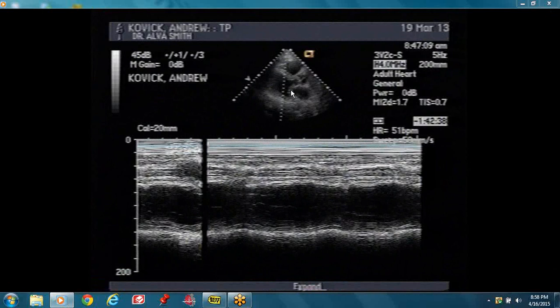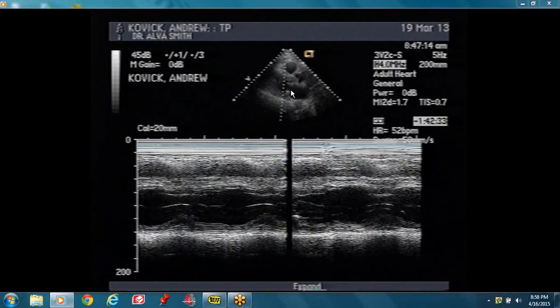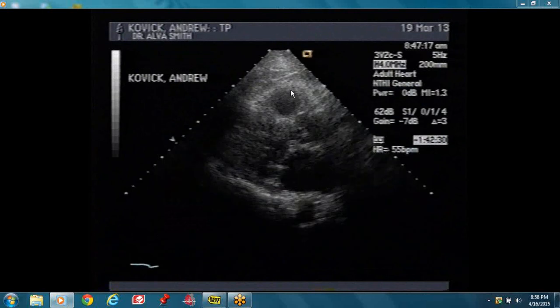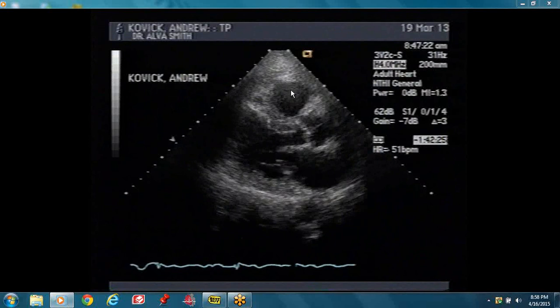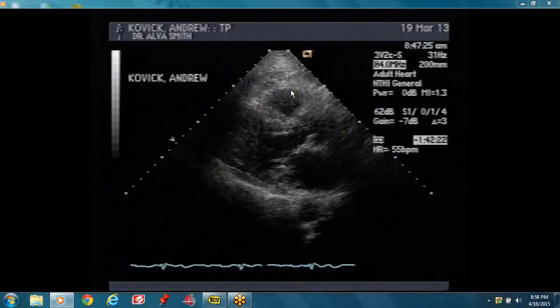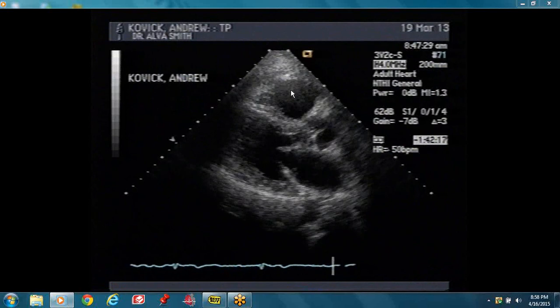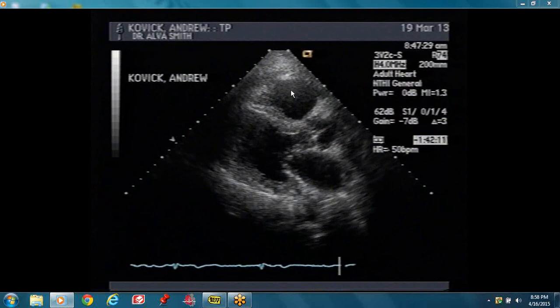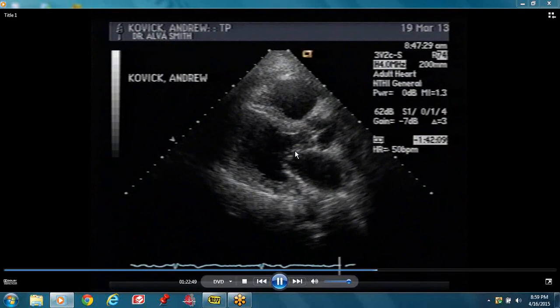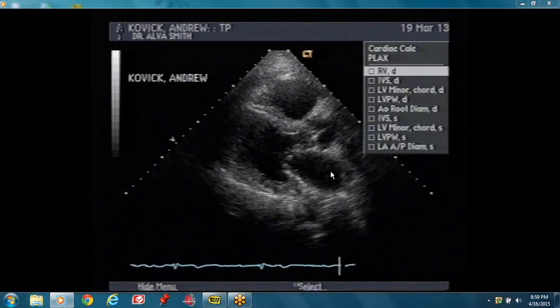This patient has aortic stenosis, so we have to evaluate the aortic valve thoroughly. Look at the valve — it's not opening. You've seen normals and you know that's not opening to the full extent. We'll describe that valve as thickened with some calcification. Compared to the normal study where closing gives a very thin line — this is a very bright line. We're going to get some measurements and determine the valve area.